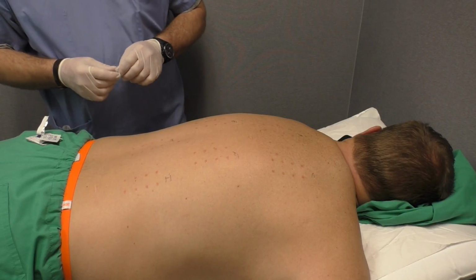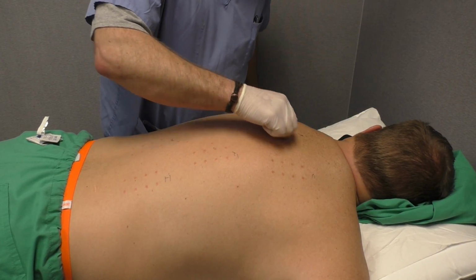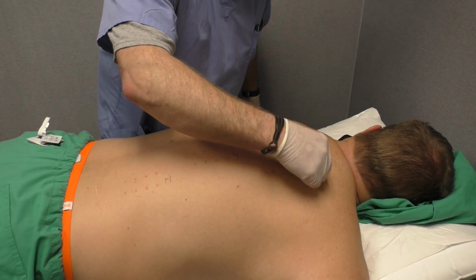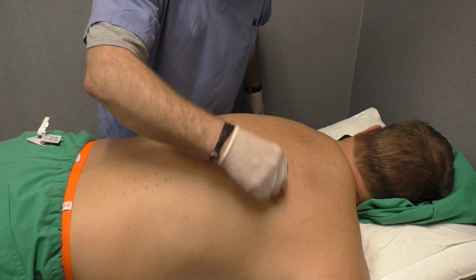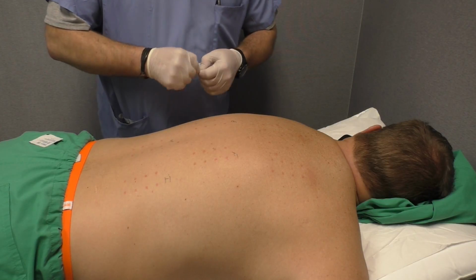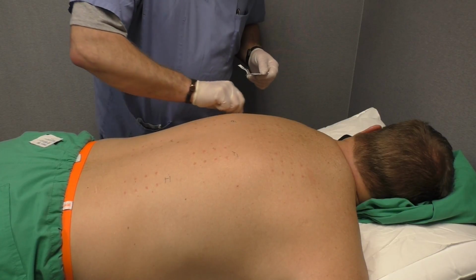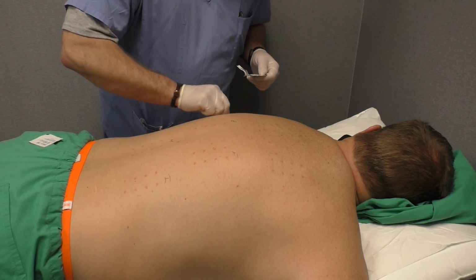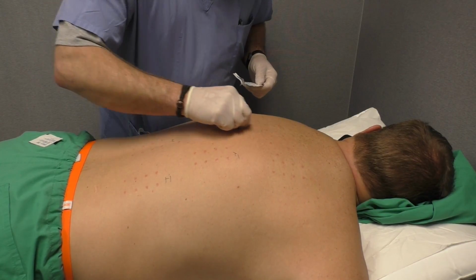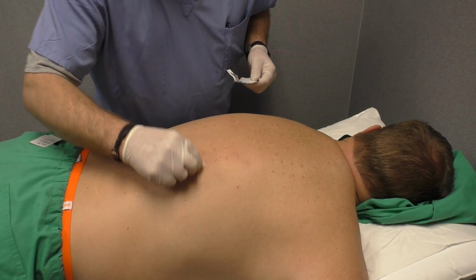After the evaluation is complete, the last two steps in taking care of the patient is to do another alcohol prep. We'll remove any of the excess allergen extracts from their back and also the marks we made with the Sharpie. Again, you may need to use more than one alcohol swab to do this. The last step after we get done doing the alcohol prep or the alcohol wash is just to grab some Benadryl or cortisone type cream, rub it over the patient's back, and that'll stop the reactions from going any further.